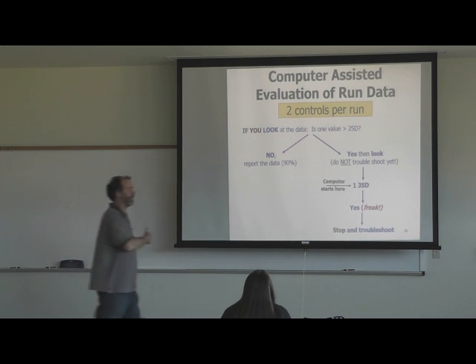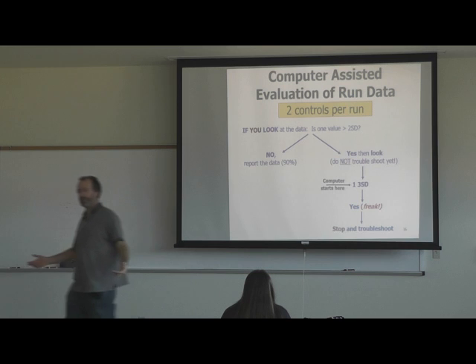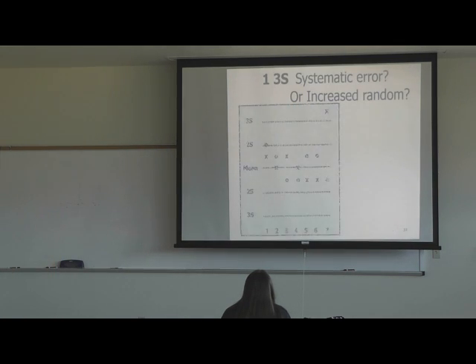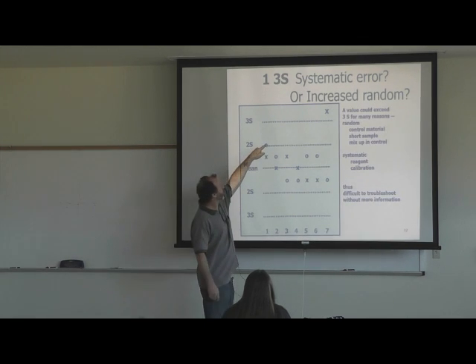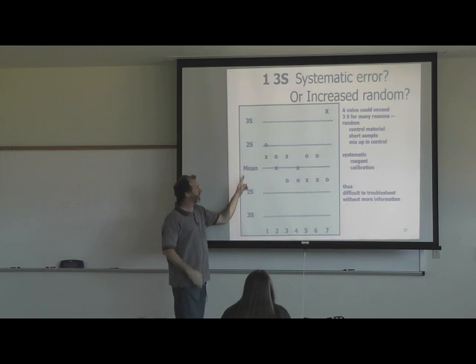Why do you have one value that's more than 3 standard deviations away from the mean? Which could happen less than 1% of the time, so it might not be anything. And this is what the data looks like, right? The O's and X's are your different samples. You could have a high quality control pool and a low quality control pool, and they just graph it against the mean and the standard deviations.